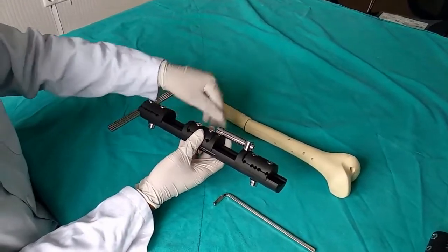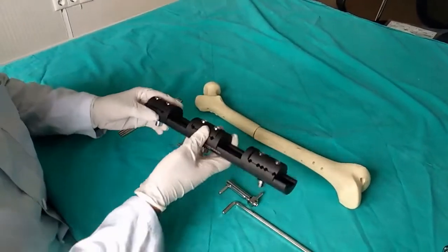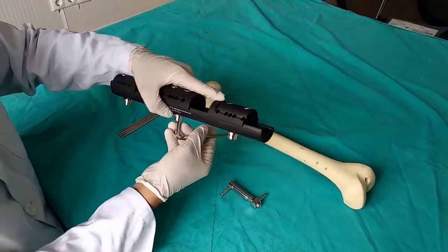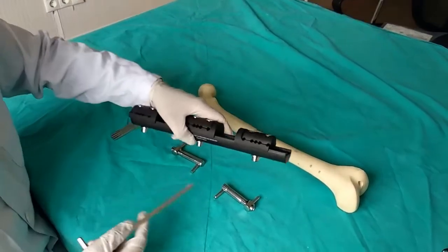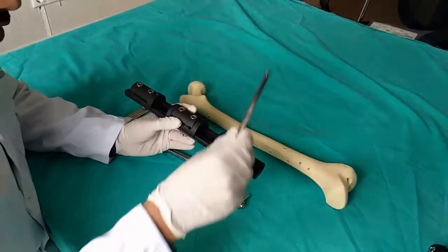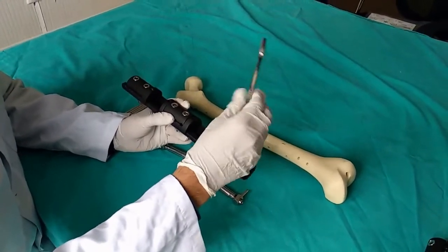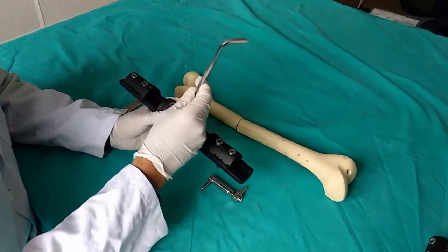We remove the compression and distraction parts and fix them slightly so they don't move too much. The second thing to do is loosen the shanz clamps. We loosen all of the shanz clamps.